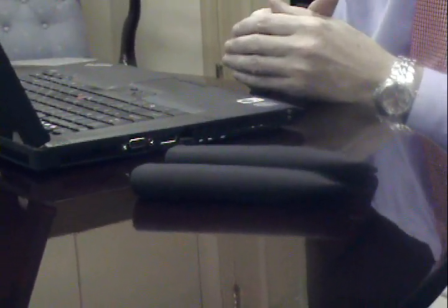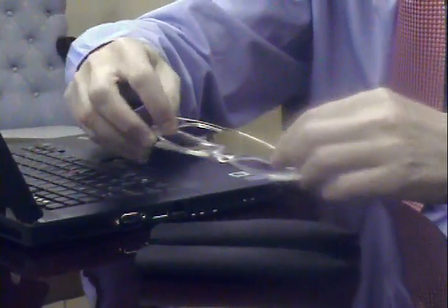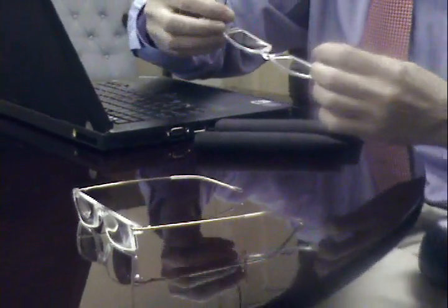Hi, I'm here to show you the new MiniFrame II Progressive Readers from Eschenbach Optic, leading manufacturer of high-quality magnification solutions. The MiniFrame II is actually available in two different frame styles — there's a gold frame and a gunmetal.